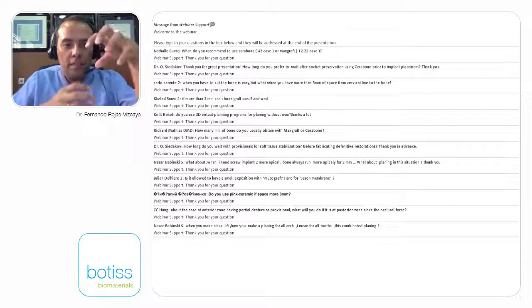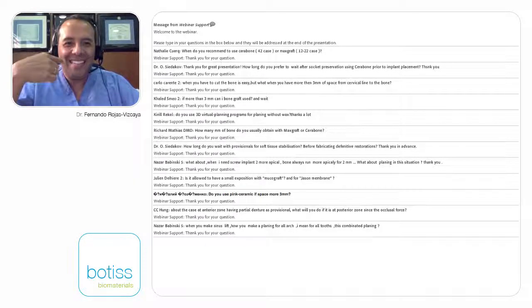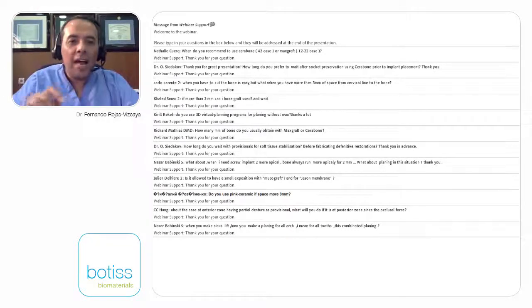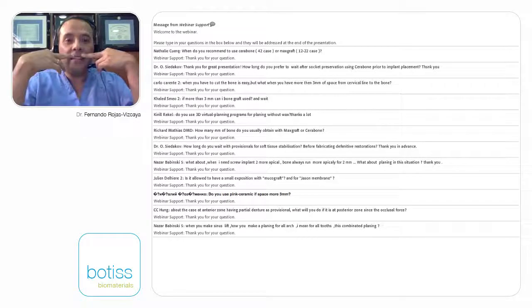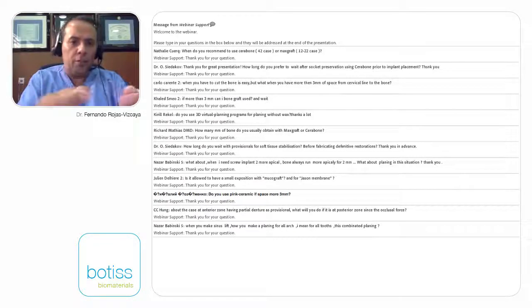Once you have the model, you put the bone and the face all together, and you can switch the face from the rest position to smiling. Remove from the scenario, put again and check in rest position, and put the new teeth for the patient. But this needs to be with a patient with some teeth to maintain the lip support. And you set the teeth virtually in rest position.